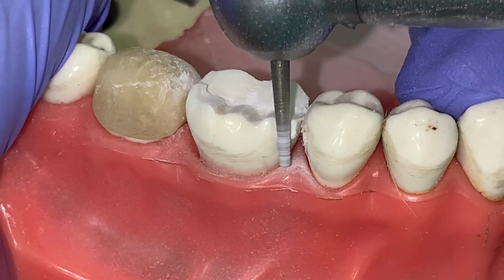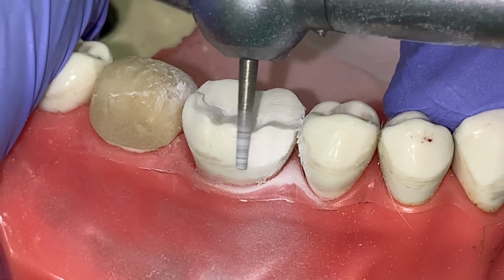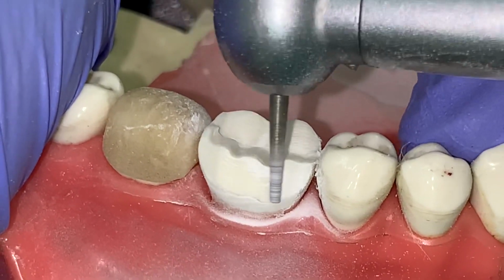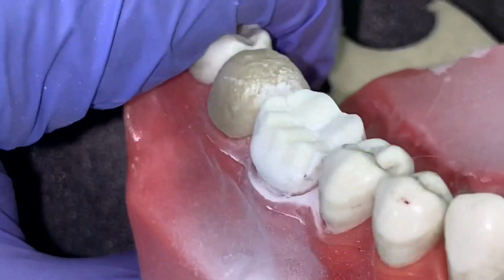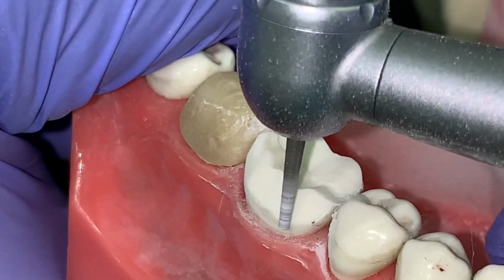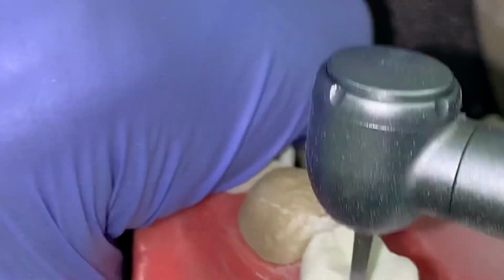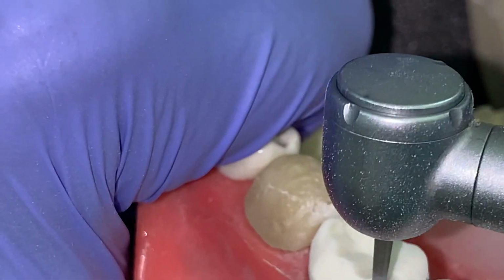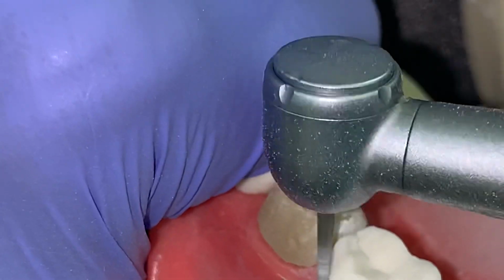Now, starting with the buccal surface reduction, the buccal surface of the lower molar should be prepared in two planes. Shortly, I will show you the two planes that I am using as a guide. If you see the natural tooth also, the buccal surface of the natural tooth is in two planes, 1 and 2. So in a similar fashion, we are going to prepare our tooth in two planes. And what that does is, your technician will have a lot of space for the ceramic to be added. This is what we call the functional cusp bevel.